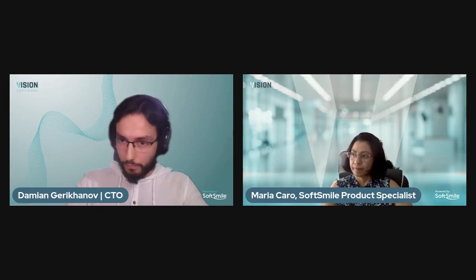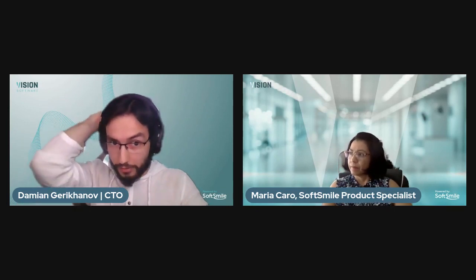So, just go with the first one. Can you redo it, please? Oh.